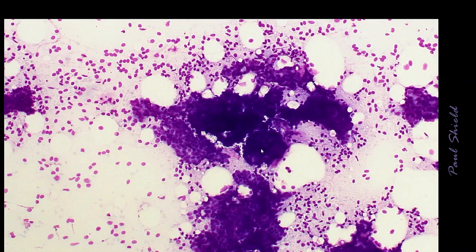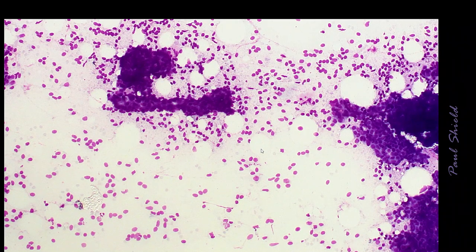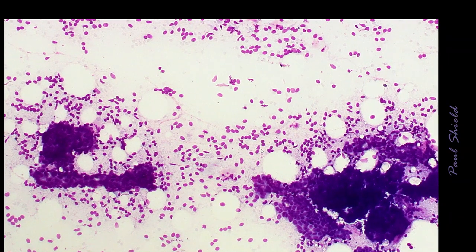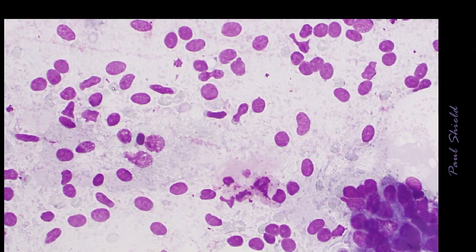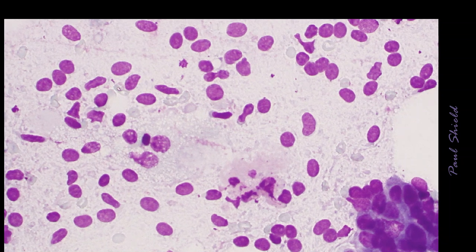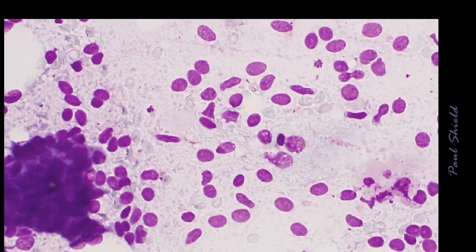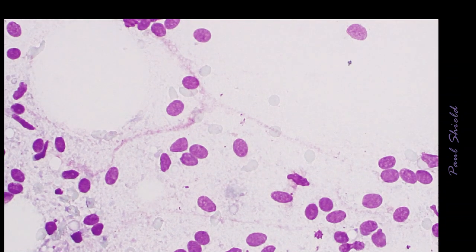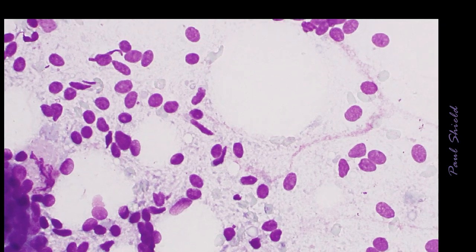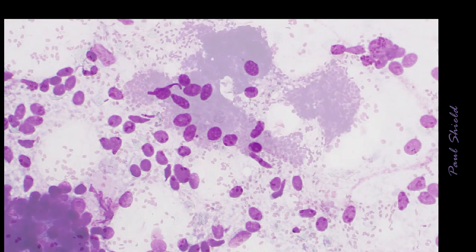And they should roughly be in proportion to the epithelial cells. So with this number in the background, I would know this is definitely not malignant. Just showing you on high power, it always helps to check and make sure they don't have cytoplasm, so they should be just stripped. They'll be variable in shape, but many of them will be quite elongate, so bipolar. Most of them here are sort of round, but we've got some definite ones with pointy ends.